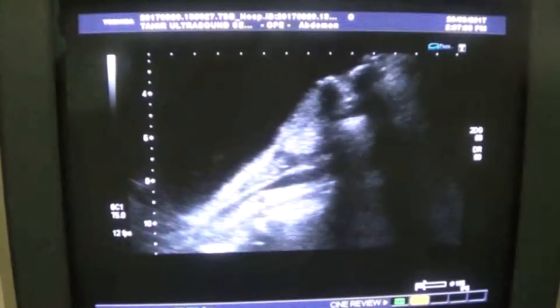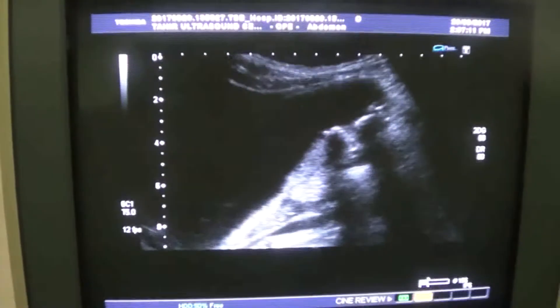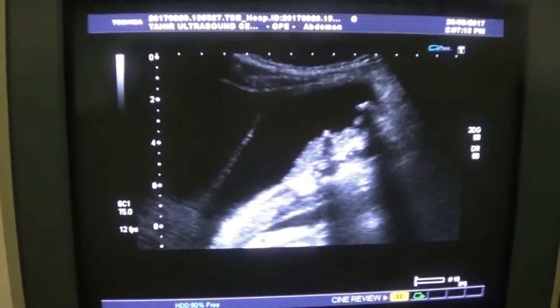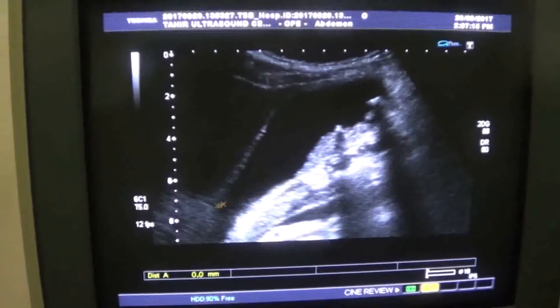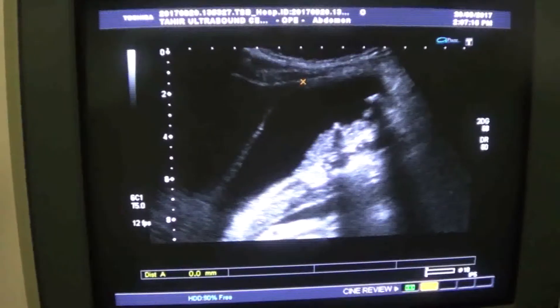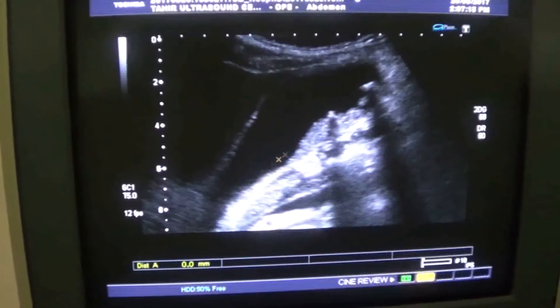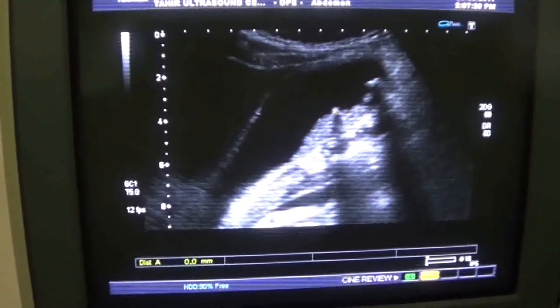What I am showing you is the fundus of the gallbladder. This is the anterior wall, fundus, posterior wall. This is the sludge.